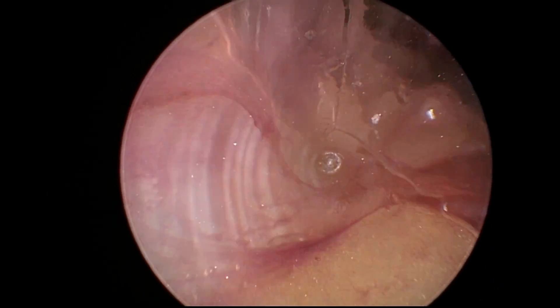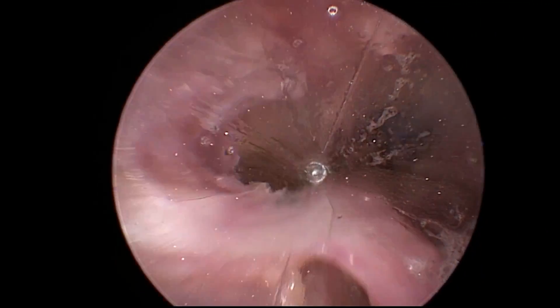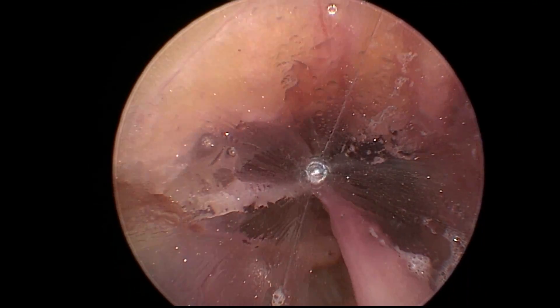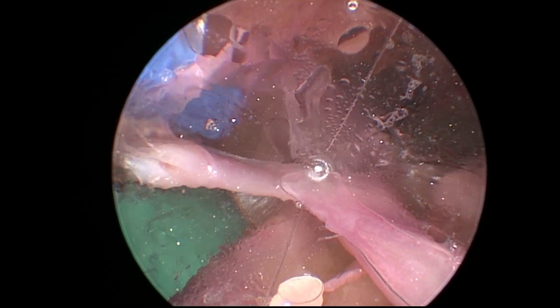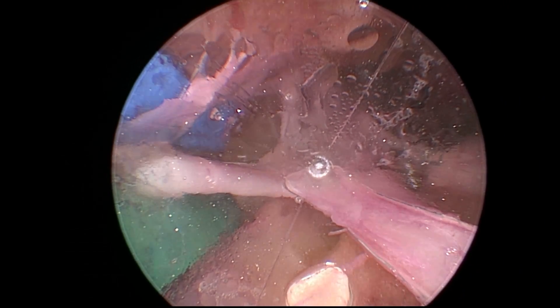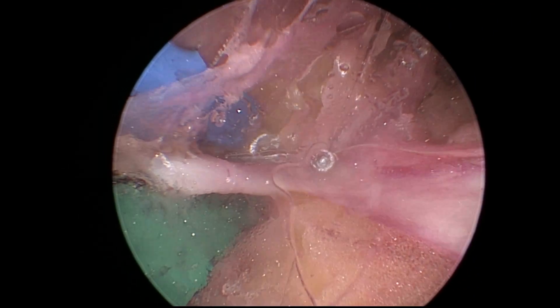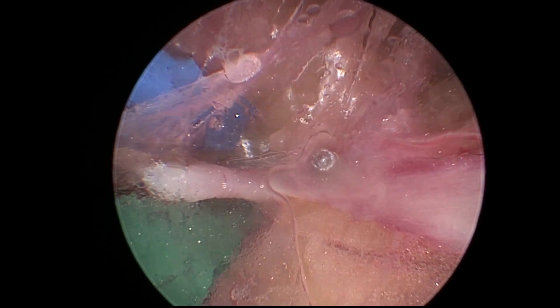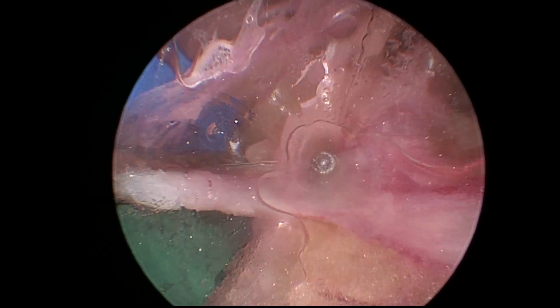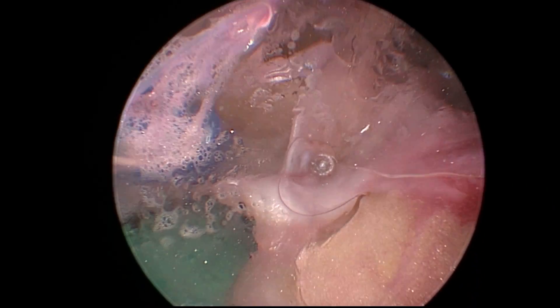Here I clean off the tip and go back to the same area on the branch. I close the fingers on the branch, engage the bovie, and just open about a millimeter — you'll see a little bit of spray. I do it two or three times, then push out towards the periphery with the fingers open about a millimeter, engage the bovie, and advance about a millimeter. The branch is now cut.